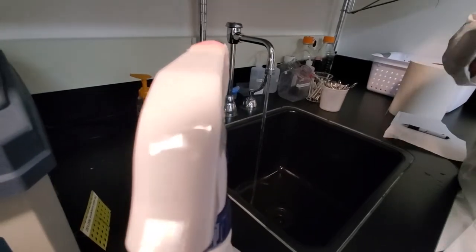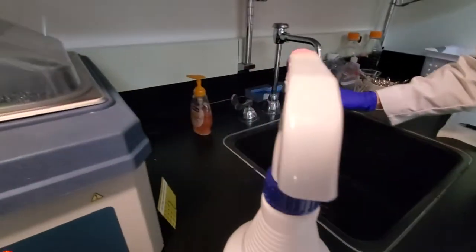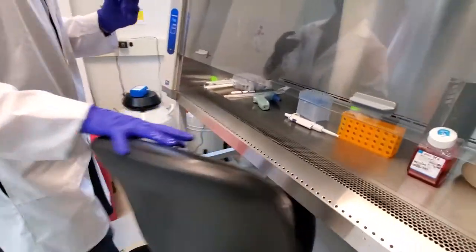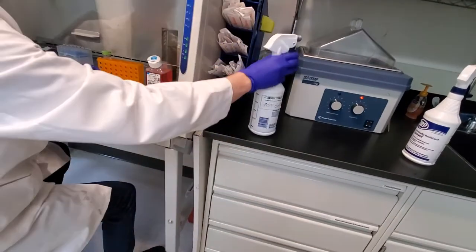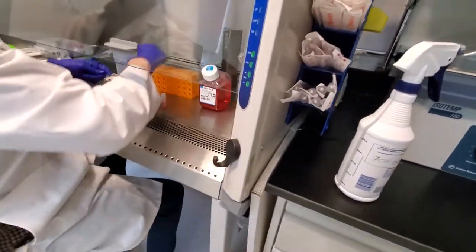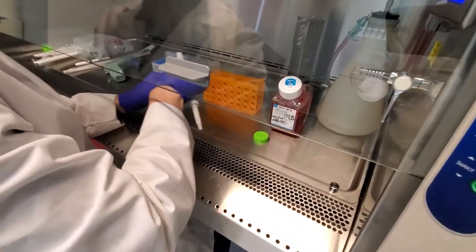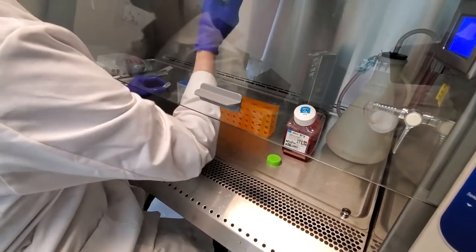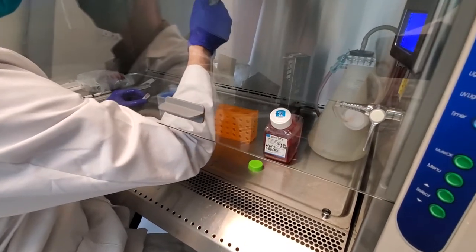All right. Yeah, I'd say there's about a chunk this wide still in there. So it's almost done. This is hard, I'm just moving quickly without showing you too much because it's so hard to see. Plus you don't want the cells to die at this point. So at this point, if your cells are really delicate, you can add them drop wise, or spread this out on the plate and add fresh media drop wise. These are pretty hardy, so I'm just going to add them right in.